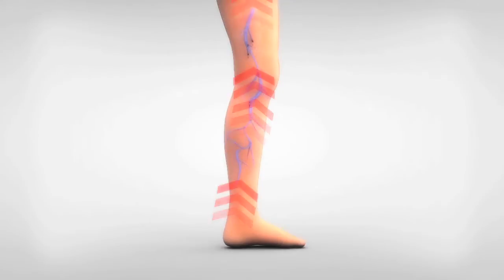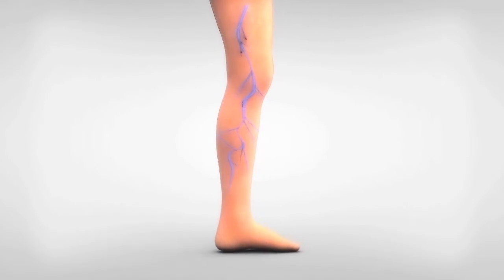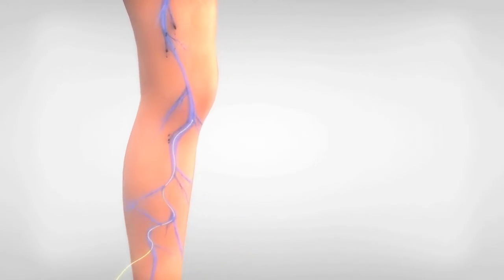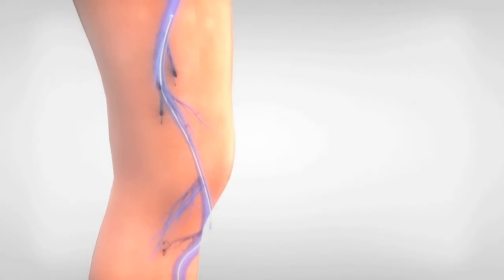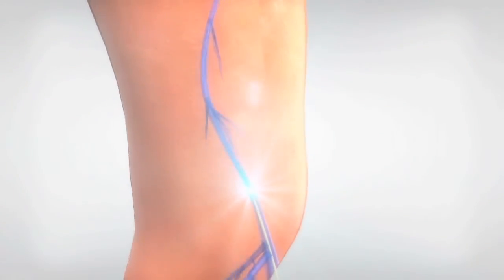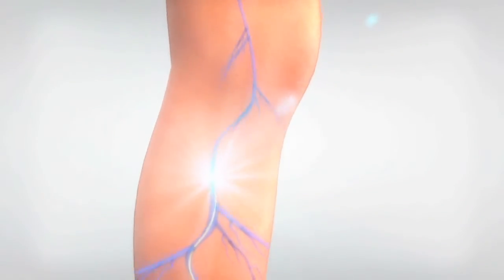Due to the poor circulation in the vein trunk, blood return to the heart is slowed. Through endovenous laser therapy and by using an ultrasound, we can guide a small laser into the trunk or saphenous vein of the leg, which then heats and closes the vein as the laser is slowly removed.